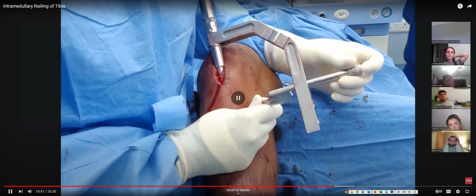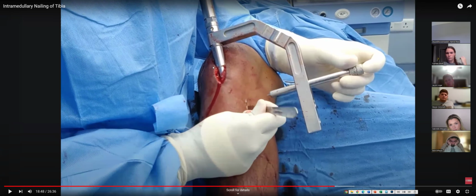then use the knife. Again, here you see this device is larger than this area of incision. So we must be careful with the pressure on the skin here, because there is bone beneath this skin and it may be damaged. This is one of the things that is important in considering designing these devices.